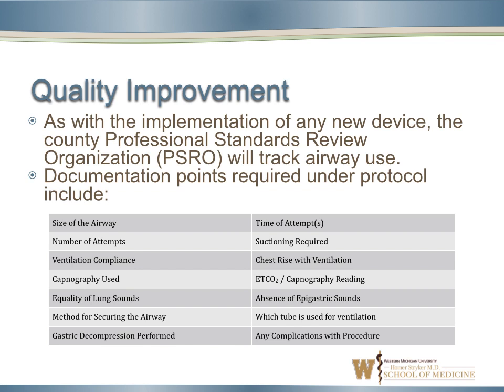As with the implementation of any device, the county PSRO board will track the airway use, whether it's for respiratory arrest or cardiac arrest.